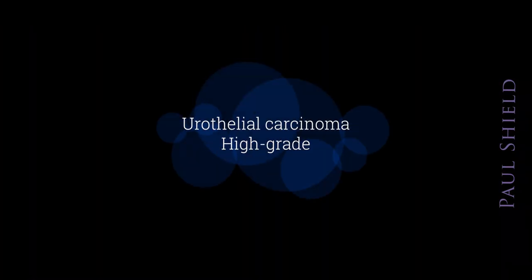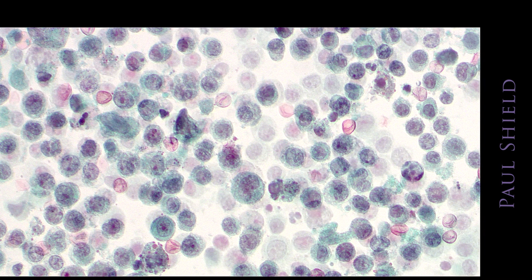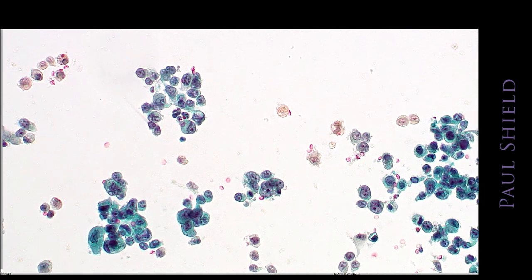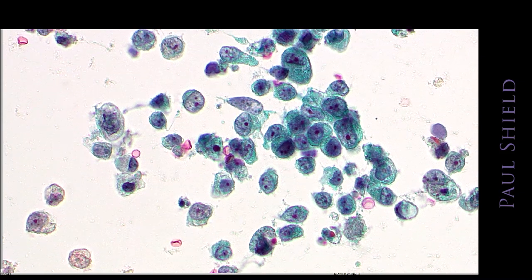Let's have a look at high grade. This is the focus of urine cytology, and this is a typical high grade field. There is quite a bit of degeneration in some of these cells here, but we've got as well some really obvious malignant looking nuclear chromatin. Here you can see very high NC ratio cells, kind of coarse chromatin.